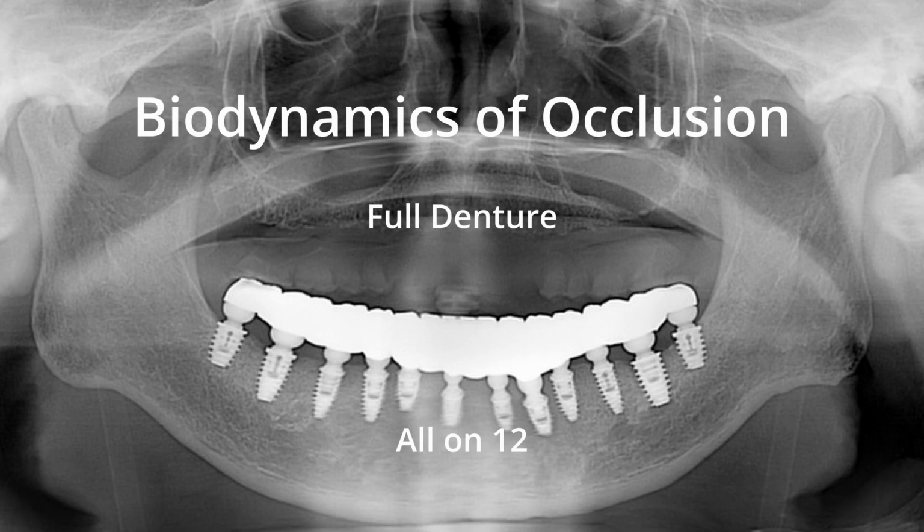Oral scanner companies also actively promote AllonX. They advertise that implant prostheses can be easily fabricated using intraoral scanning. They emphasize only the advantages of new technologies, including modelless techniques. They claim that everything can be done quickly and easily, but reality is different. To ensure prosthetic accuracy and verification, a working cast is still required, and with intraoral scanning, a 3D printer must be used. Ultimately, this places us in a situation where treatment precision and stability cannot be guaranteed.